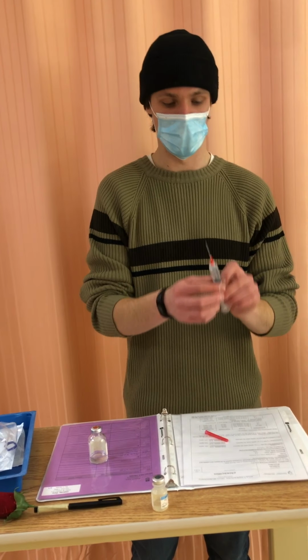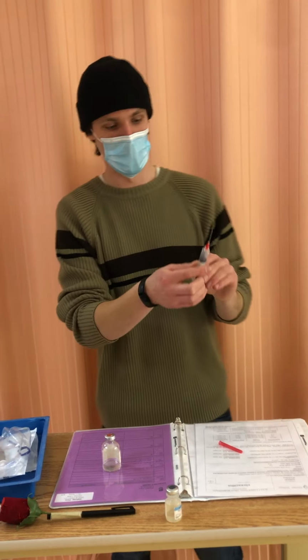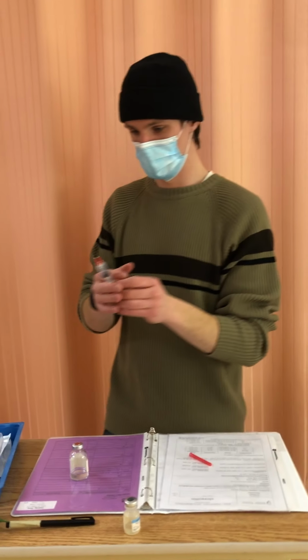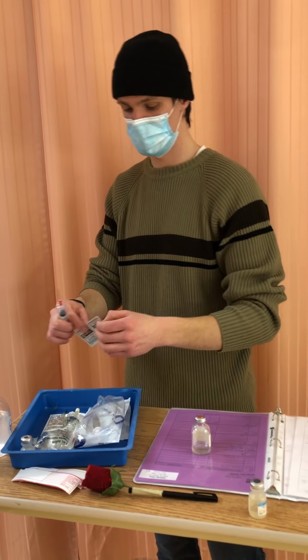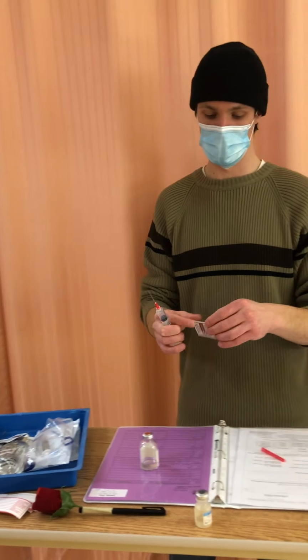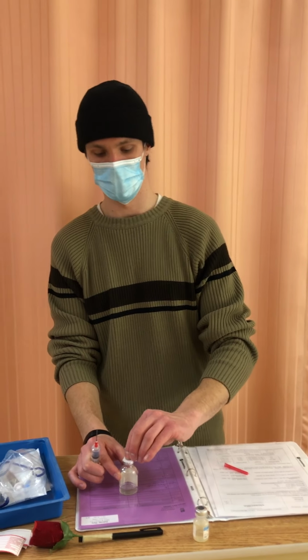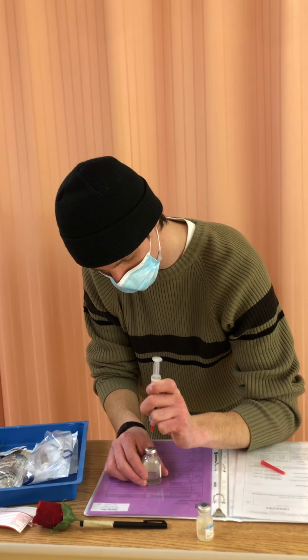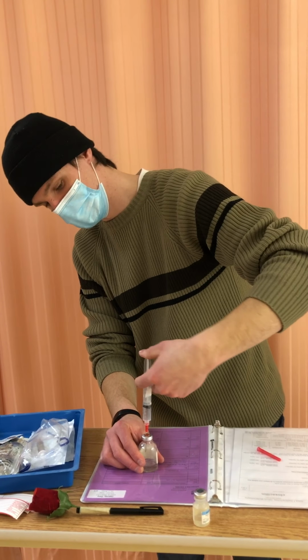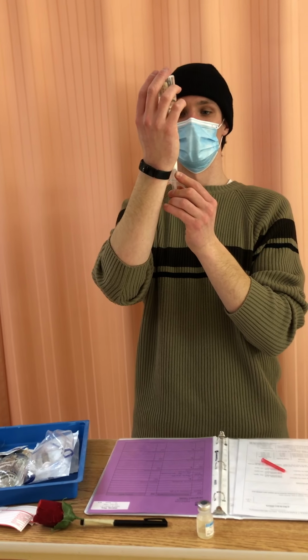So again, I'm going to draw out 4 milliliters of air. I'm actually going to swab the top of the vial again in case I contaminated it in the process here. 30 seconds, let dry for 15, and go ahead and inject 4 ml of air and draw out 4 ml of medication.